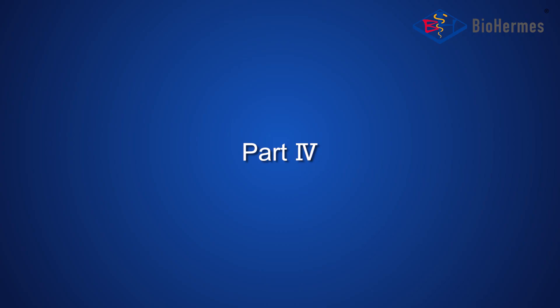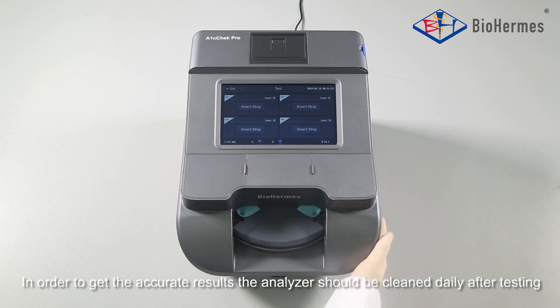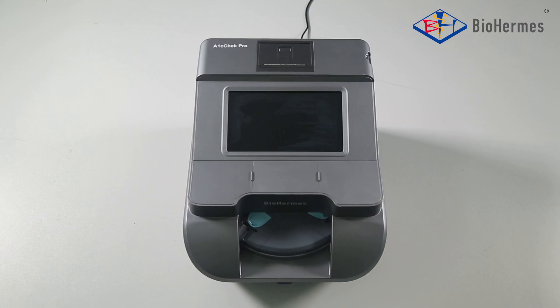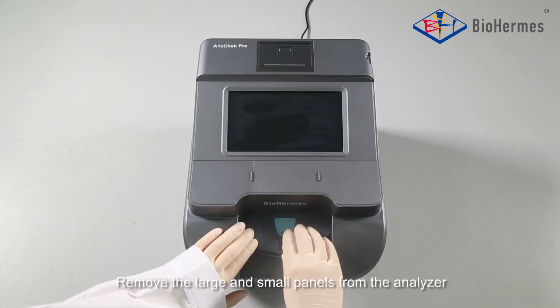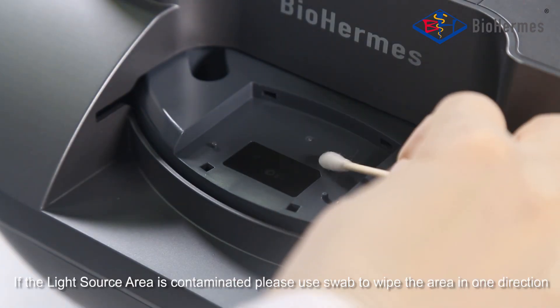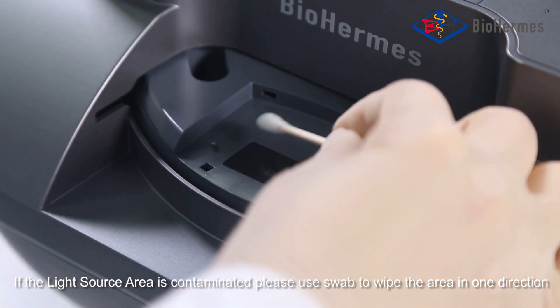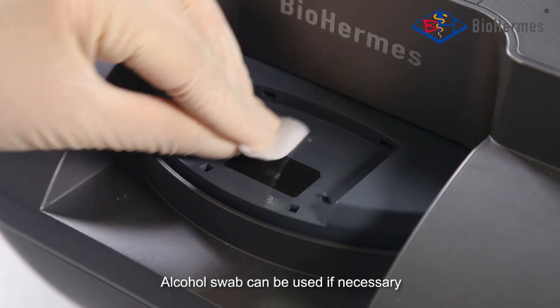Part 4: Maintenance and Cleaning. In order to get accurate results, the analyzer should be cleaned daily after testing. Remove the large and small panels from the analyzer. If the light source area is contaminated, please use a swab to wipe the area in one direction. Alcohol swab can be used if necessary.